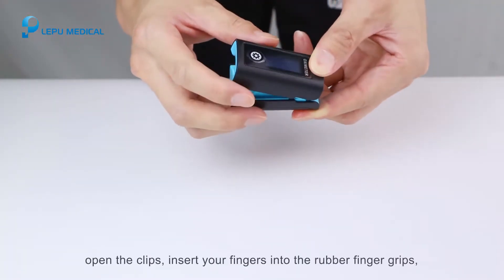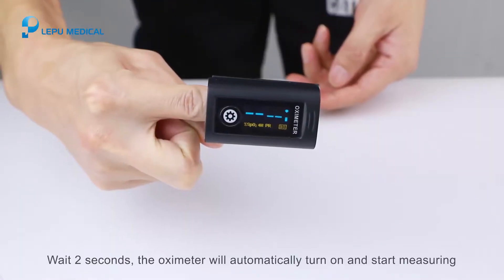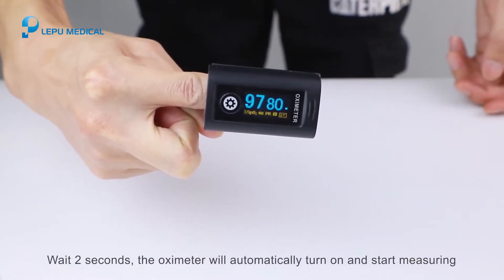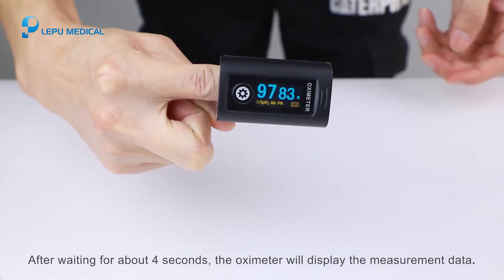Open the clip, insert your finger into the rubber finger grips, and release the clip. Wait two seconds and the oximeter will automatically turn on and start measuring. After about four seconds, the oximeter will display the measurement data.